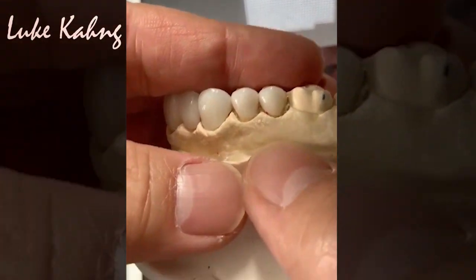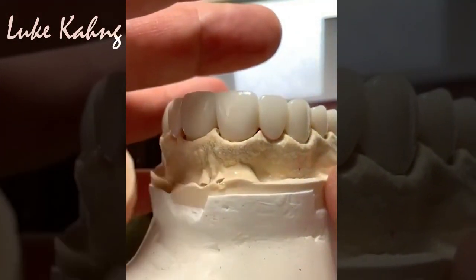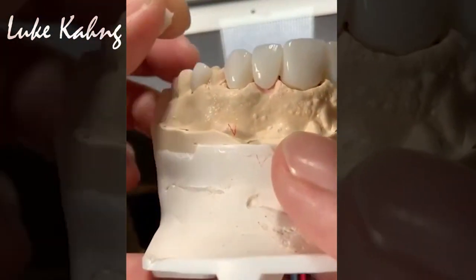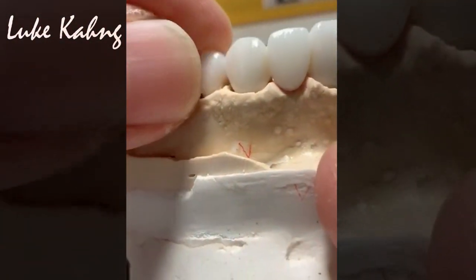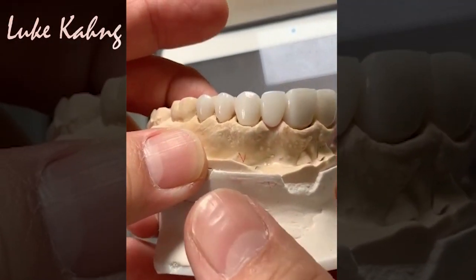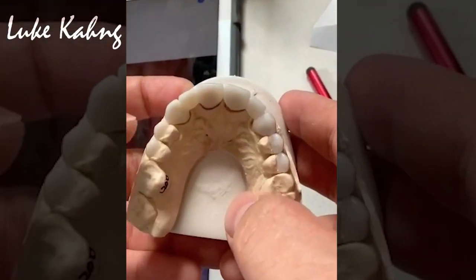Pure cosmetic color. Right. You see? And then we finish this. Okay, it's very delicate. Good. Now, when you see here, a little more detail for occlusion.